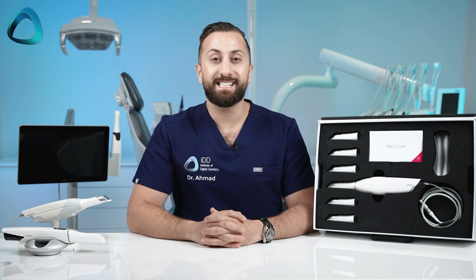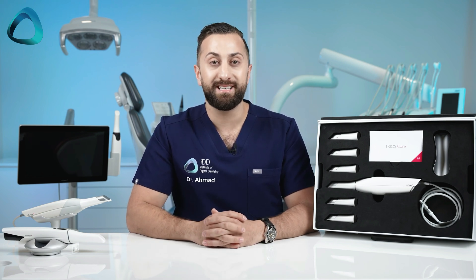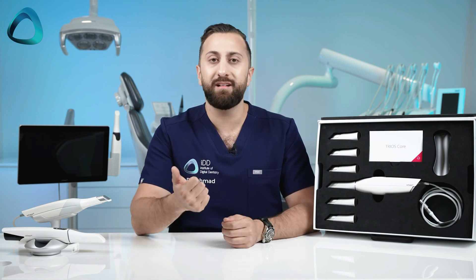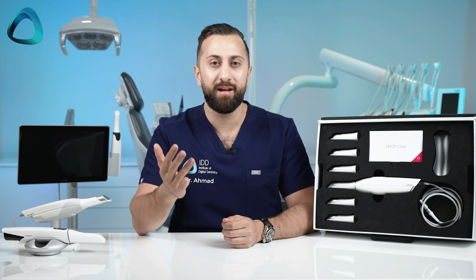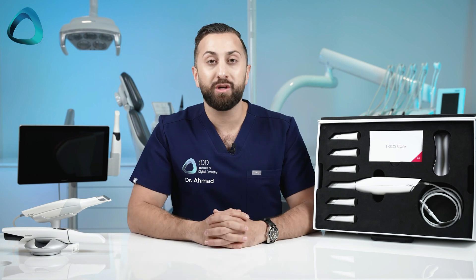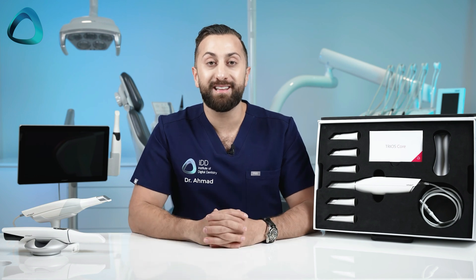Regarding scanning, I have tried this scanner and it feels exactly like the proven and tested Trios 3. Everything you liked about that scanner is basically the same here, hardware-wise. It is a proven technology for everything from single units, bridges, ortho, implants, full arch, edentulous scanning, etc. And frankly, the Trios 3 was always a fast scanner — my personal record of a full arch scan using the Trios 3 was around 15 seconds on a real patient, not a model.